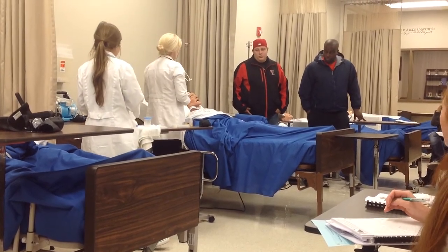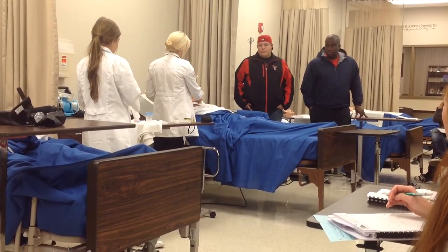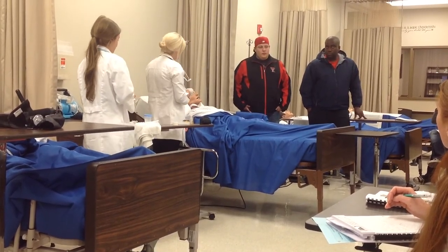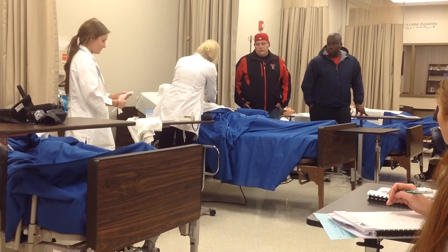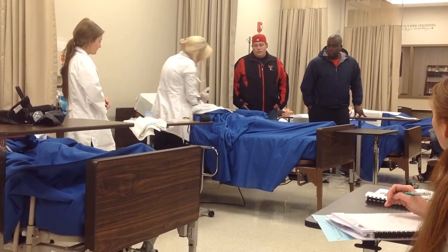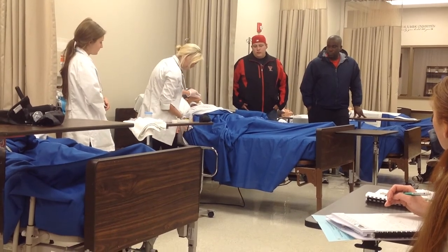And so when you enter your airway, you're just going to turn it towards the back of the patient's cheek and then flip it over. So then the end will be like this, like it's holding down their tongue. It's a little hard. And flip it over, and then you're going to want to secure it with tape.